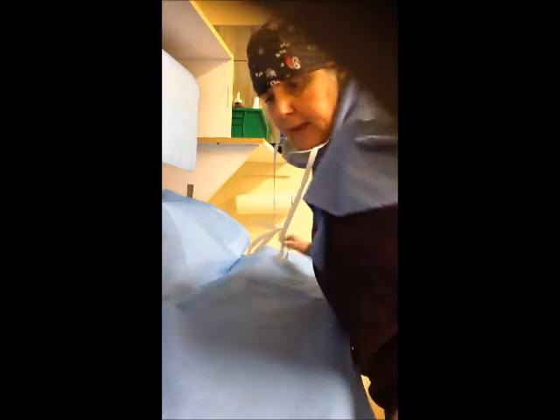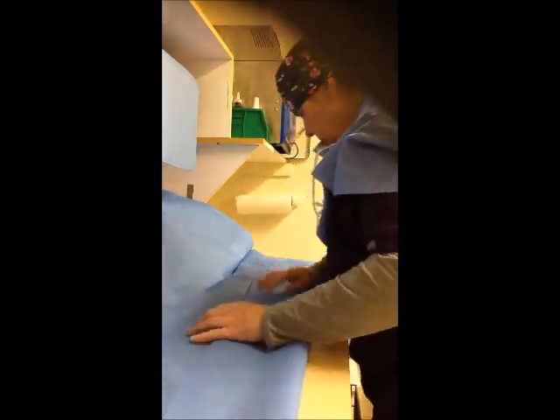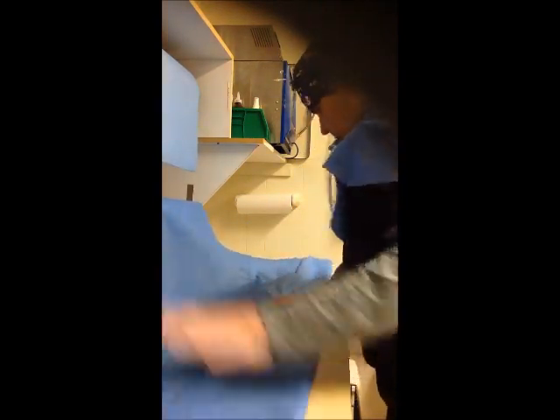And then as that dries, part of our laceration pack, we also use a drape. So we're going to fold this accordion style, just as I would a normal drape.